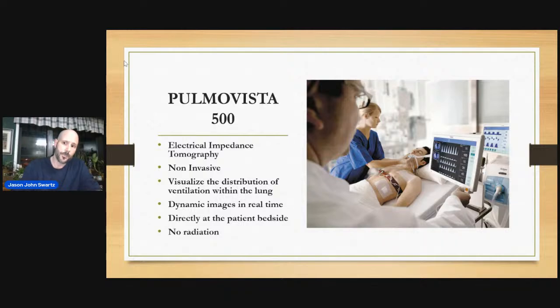Unlike, for example, a CT scan that uses radiation, where the RT brings the patient down to CT. The RT wants to see that chest CT, wants to see if there are any dorsal issues. But as far as the RT who is concerned about that CT scan, looking at the aeration, the consolidations, the lung collapse, you don't have to have a CT scan.